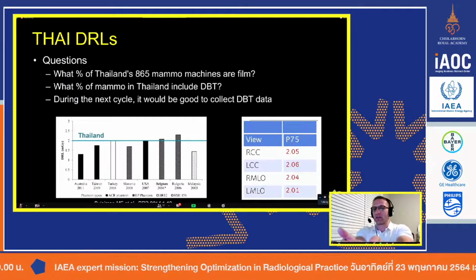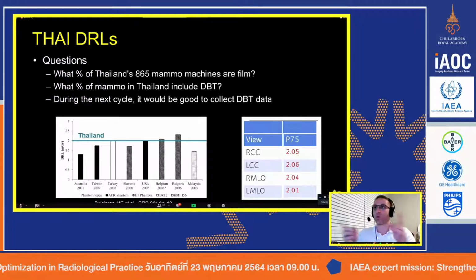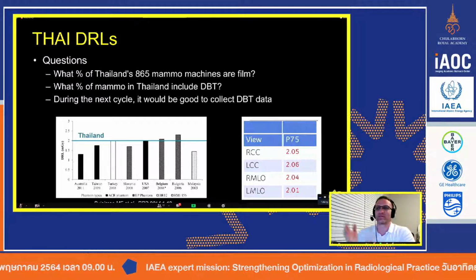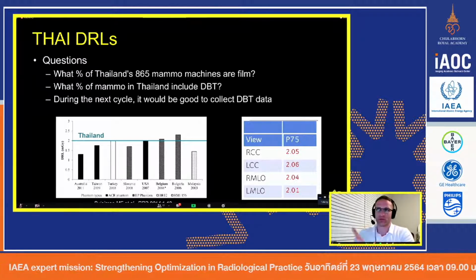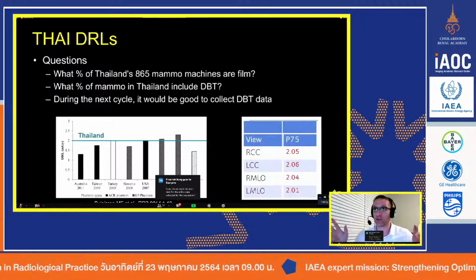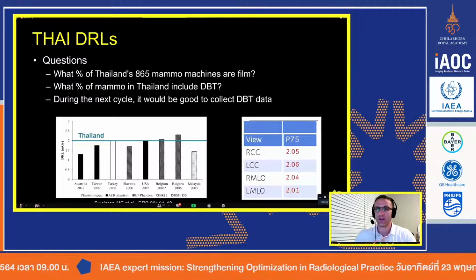This value right here, 2 milligray, is great for when you walk into any hospital, any imaging clinic, and you say, irrespective of the woman, be it a 35-year-old high risk or a 70-year-old woman who's been getting mammograms for 20 plus years, what we're saying here is any one of those women on average should get 2 milligray per view. And if you're doing that, that's great. Some of these women with bigger breasts, the compression is not as much. So let's say it's an 8 centimeter breast instead of a 4 centimeter. It's going to be higher than that.